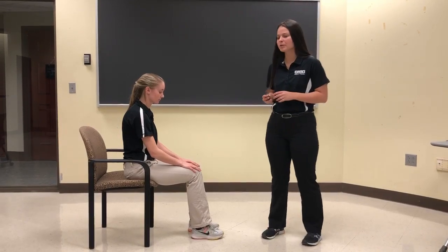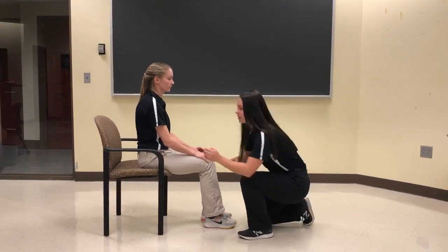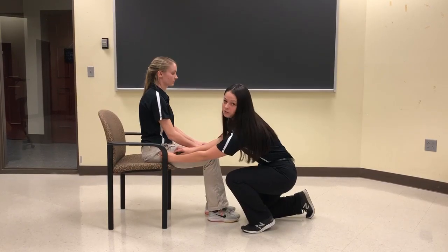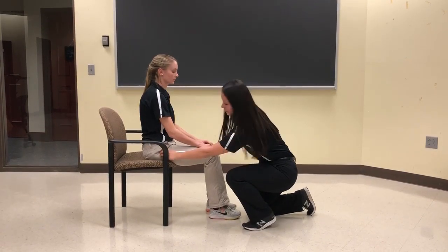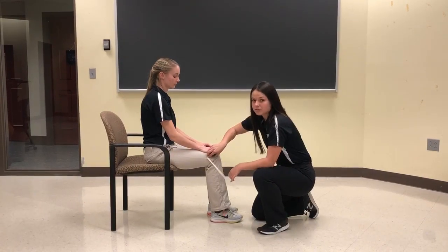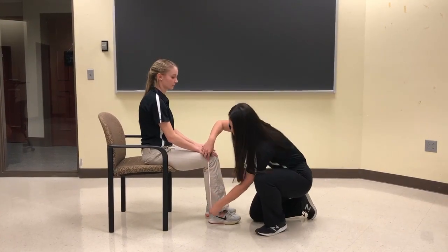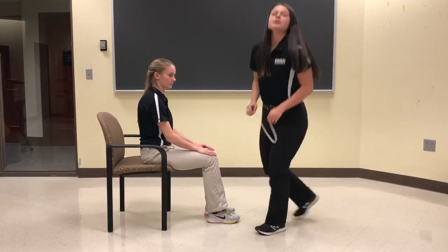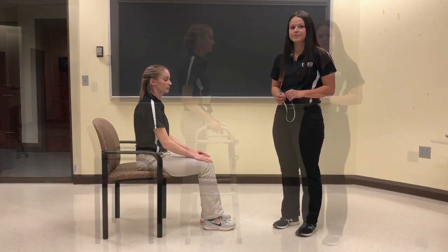Next, I'm going to be demonstrating how to fit a walker to a patient. First, you will want your patient sitting on the edge of the chair with their heels flat on the ground and their shoes on. You will begin by palpating their greater trochanter, and then measuring in centimeters from their greater trochanter to their lateral epicondyle. You will then measure from the lateral epicondyle to where the heel meets the floor. Then you will add those 2 measurements together and adjust the hand grips of your walker to that height.